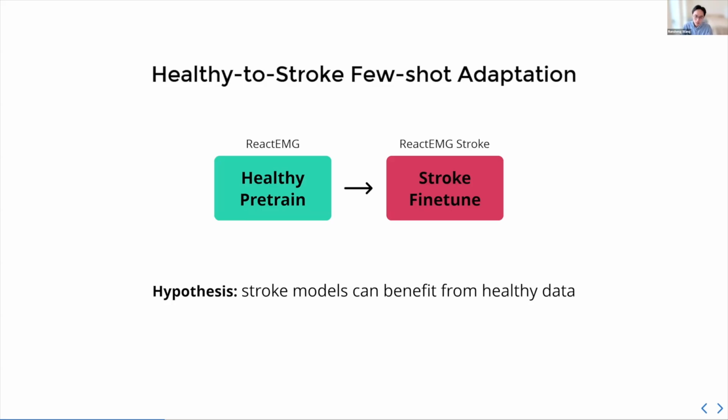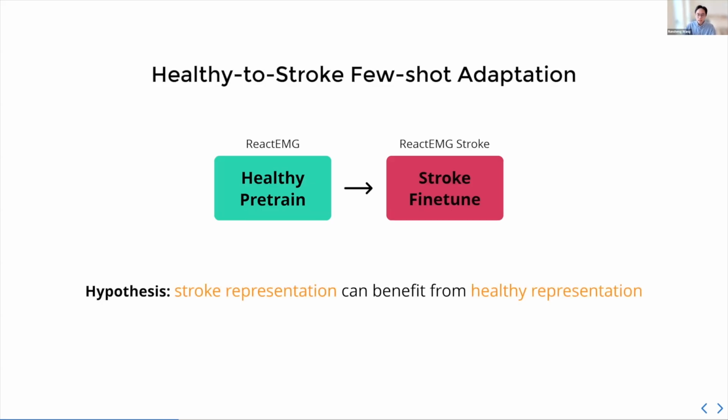But we think it's still worth investigating because when you think in terms of models, stroke can really be seen as a deviation from this healthy manifold, this healthy representation space. We think that learning this deviation from healthy is actually easier than learning everything from scratch. This is the fundamental idea that we're trying to pursue here. A better way to formulate the hypothesis, therefore, is: are the representations transferable and useful when we start not from random, but from an initialized pre-trained space from a healthy model?